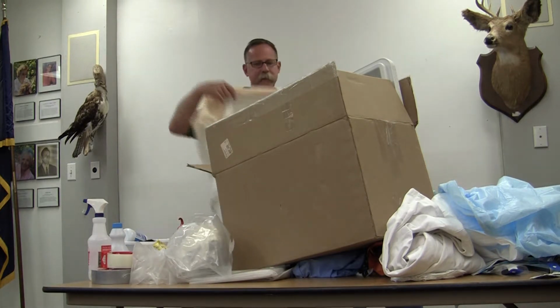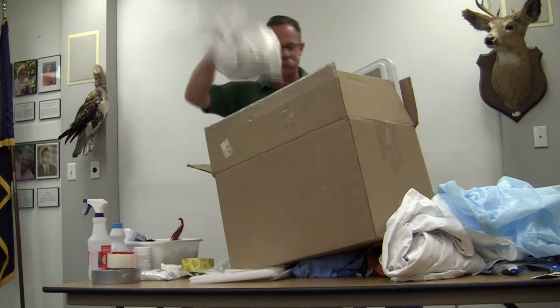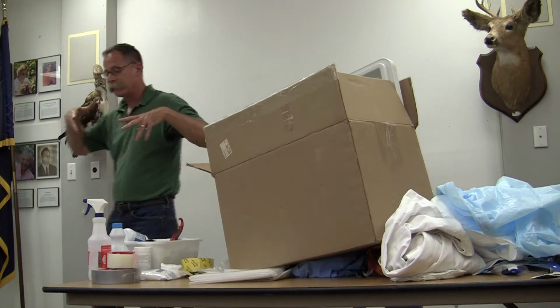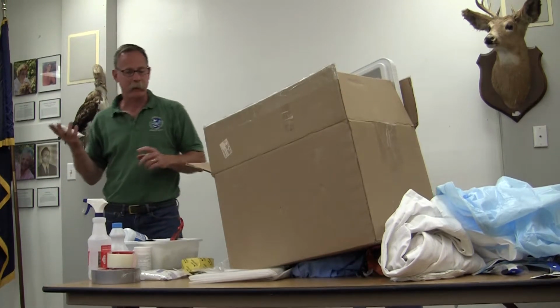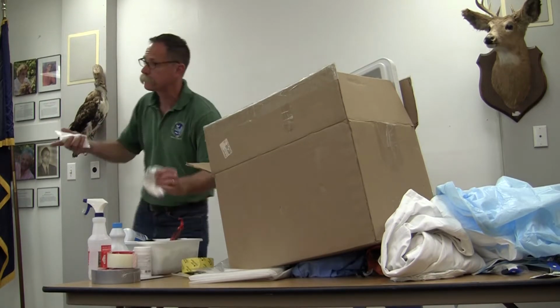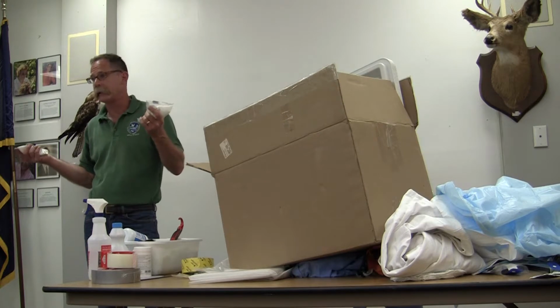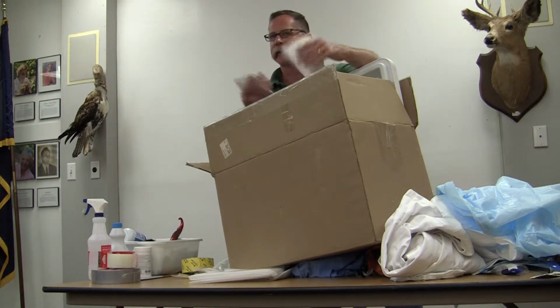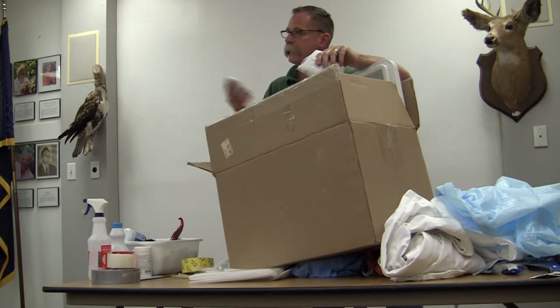So you line the inside of the bottom of the cooler with an absorbent pad. That'll collect any juice that comes out. Put your specimen in there. And then you want to put enough ice packs in there that are going to keep that animal cool. Now bear in mind, if you just shoot a raccoon and you bag it up, it's like 100, 101 degrees depending on what was going on with that raccoon. And you put them in here with 2 of these ice packs, these are going to be overwhelmed in no time inside this cooler. So be liberal with the ice packs.